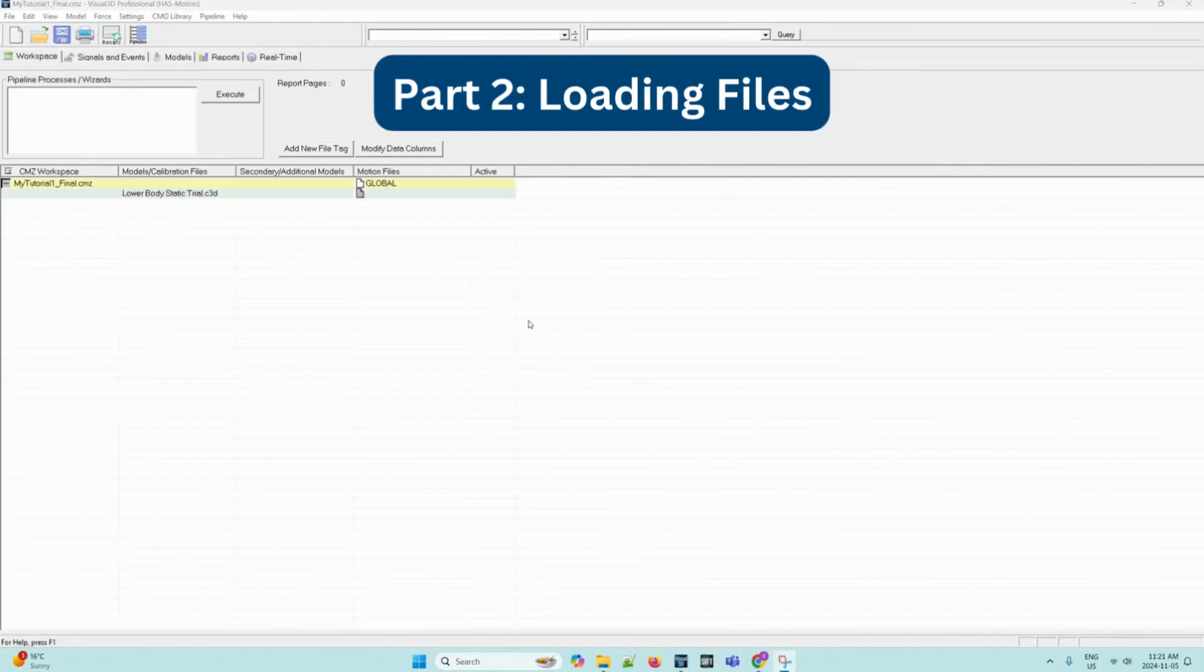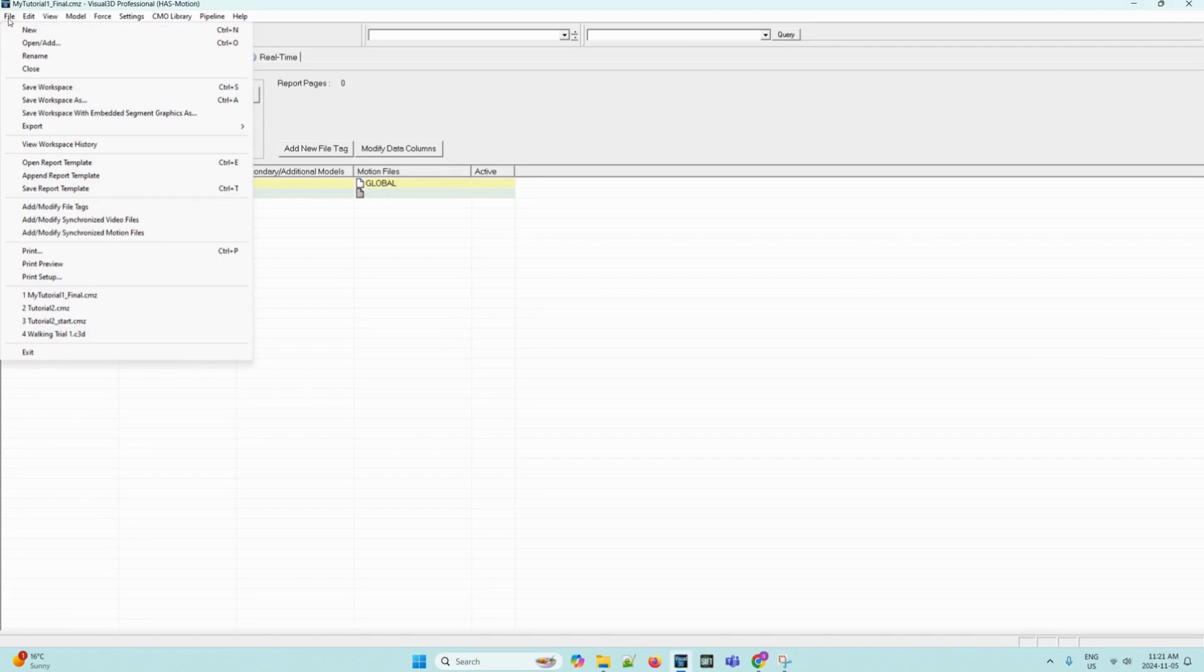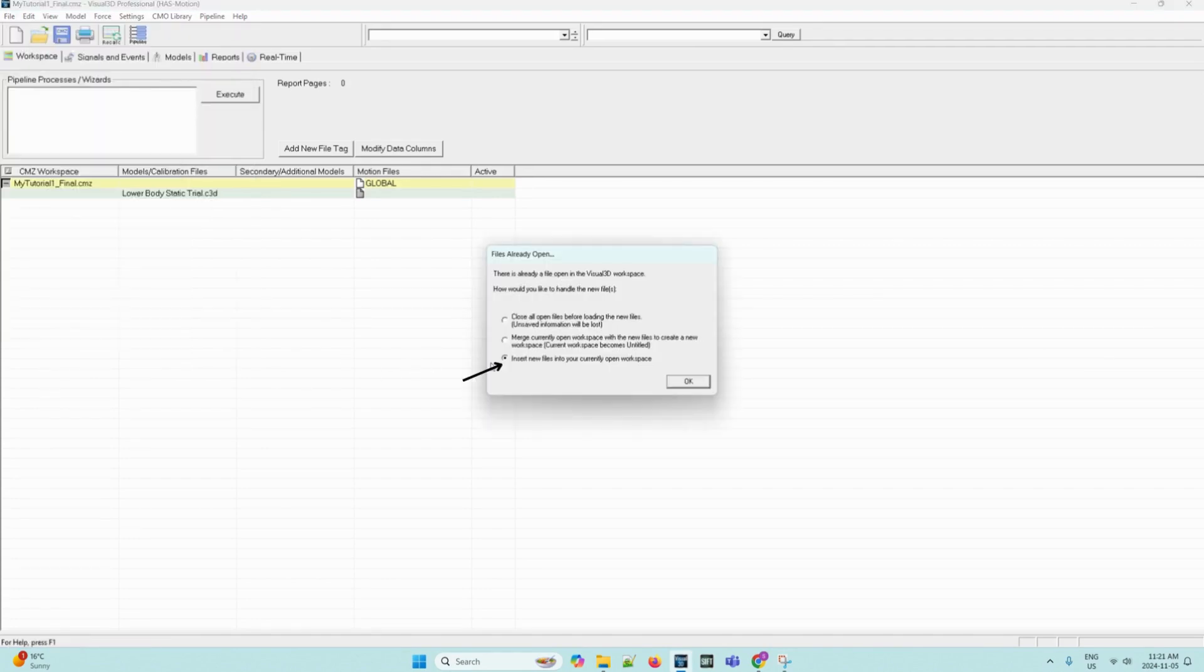With the new workspace open in Visual 3D, we can open the CMZ file saved from tutorial1. In our case, it is already open. We can verify that the model file named lower-body-static-trial.c3d is present in the column models-slash-calibration files. Then, we can navigate to the file menu and then click open-slash-add. A dialog box will appear indicating that files are already open. We can select insert new files into your currently open workspace and click OK.